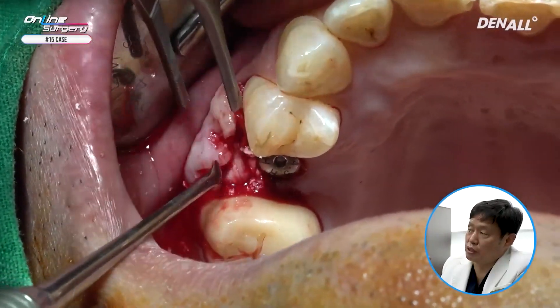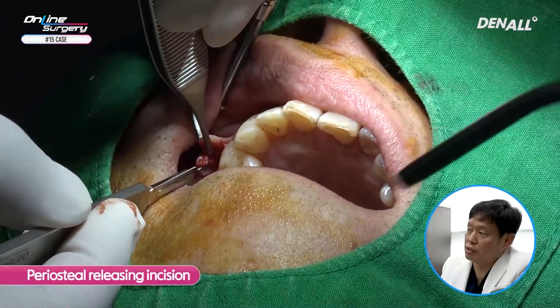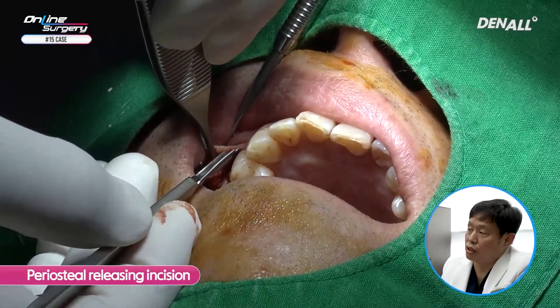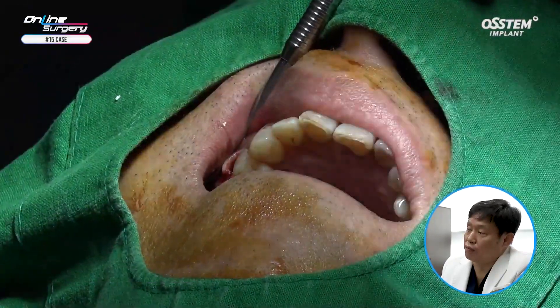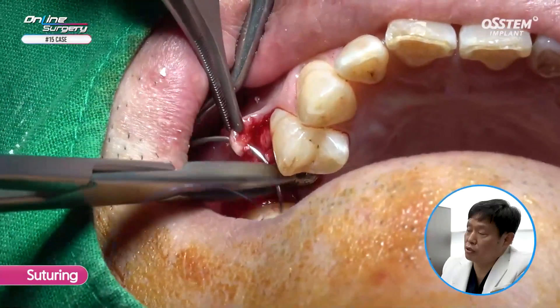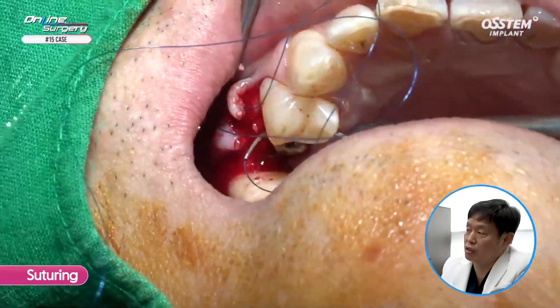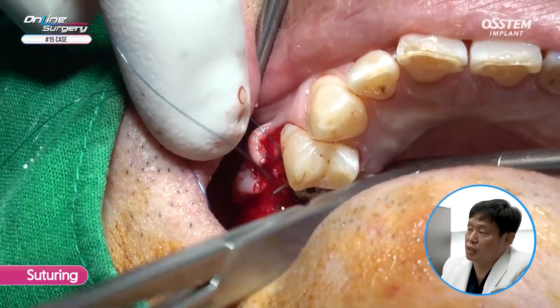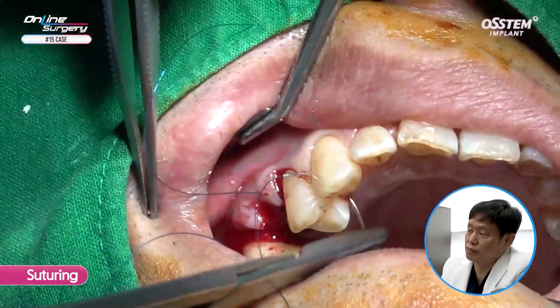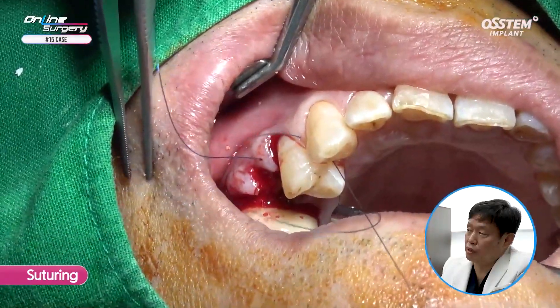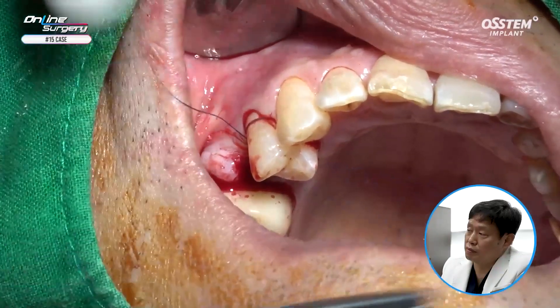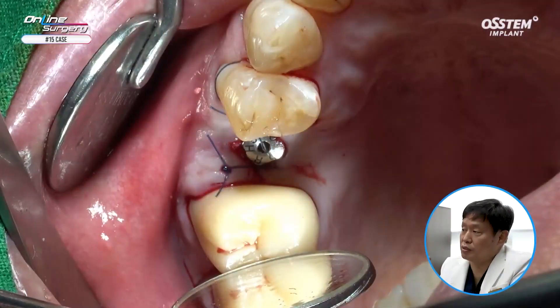Because additional bone graft was done on the buccal side, the soft tissue is a bit lacking. A periosteal releasing incision is made so that the flap is repositioned sufficiently. Because a tissue punch was used, the suture was done next to the healing abutment. The mesial tooth was used for anchor suture, the flap was pulled, and this was how the suture was done.